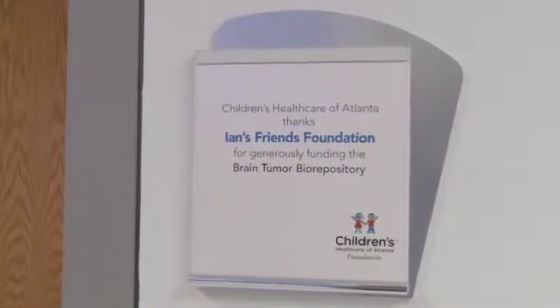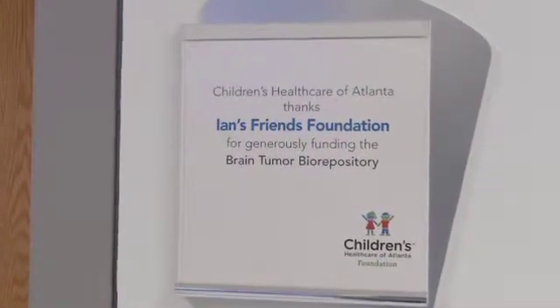The Ian's Friends Foundation Brain Tumor Biorepository can provide the basis of materials that investigators need in order to develop cures for pediatric brain tumor. The importance of having a tumor in a cell culture, having the cells actually that you look at when you're doing experiments, is important. Many of the brain tumor biorepositories that exist use tissue that isn't alive anymore.